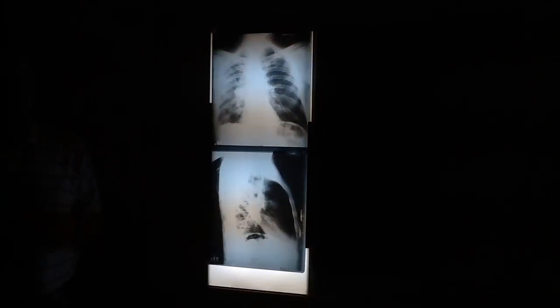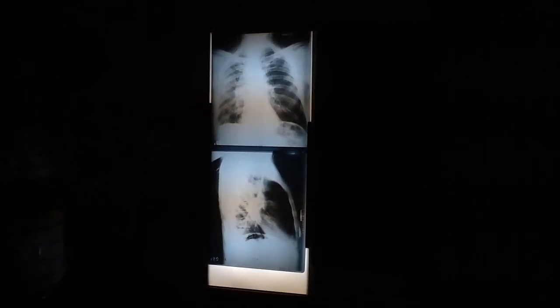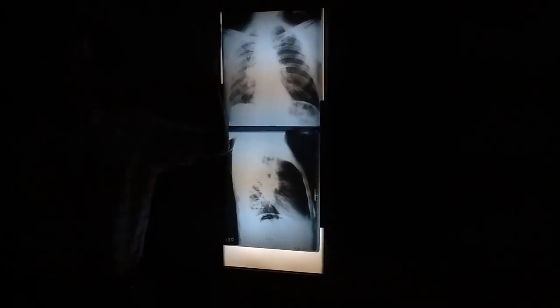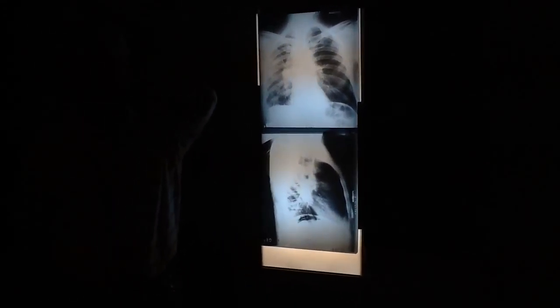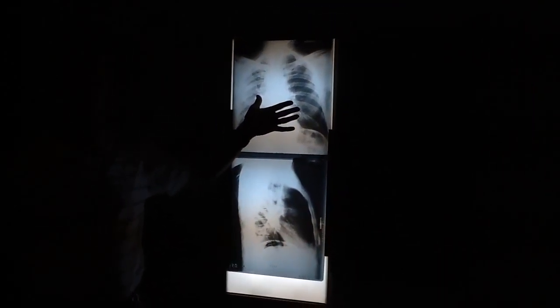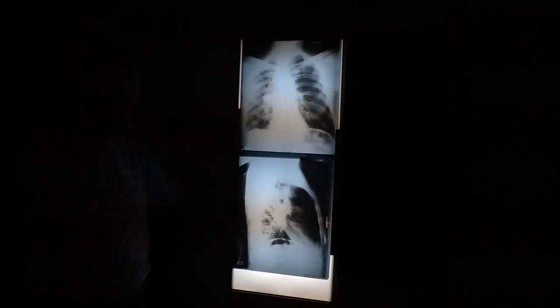It's not very good. And this could be the first film. The patient may come in complaining about upper back pain. They may say, I hurt up here. This is where it's just killing me. It's getting worse and worse. That may be the presenting films for the case. Rib destruction.